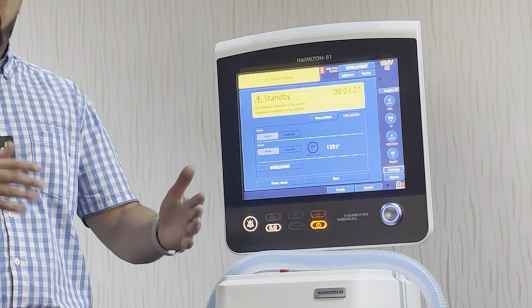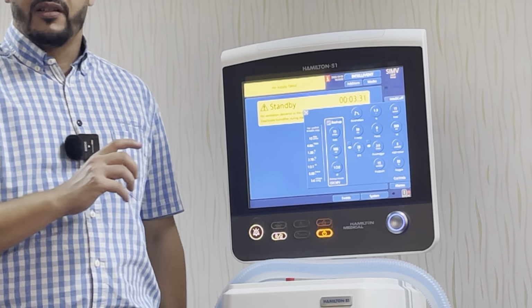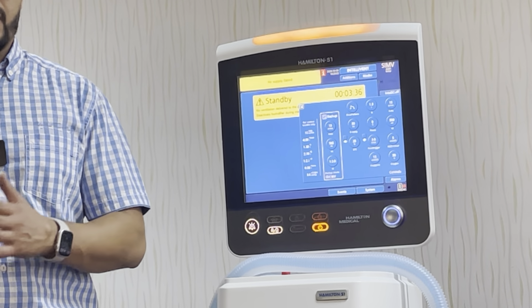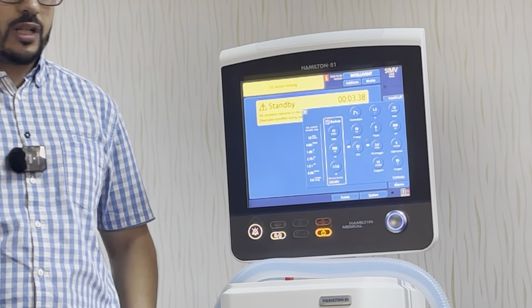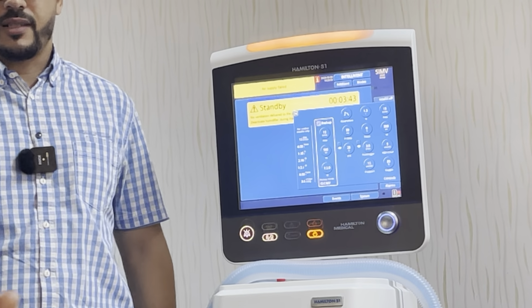لو بدا تعطيه بريشر سبورت اللي هو هذا كانه على السي باب. لو البيشنت does not trigger any spontaneous breath, the machine will deliver a mandatory breath with tidal volume of 500 كانه على السي ام في سايكل باي سايكل.